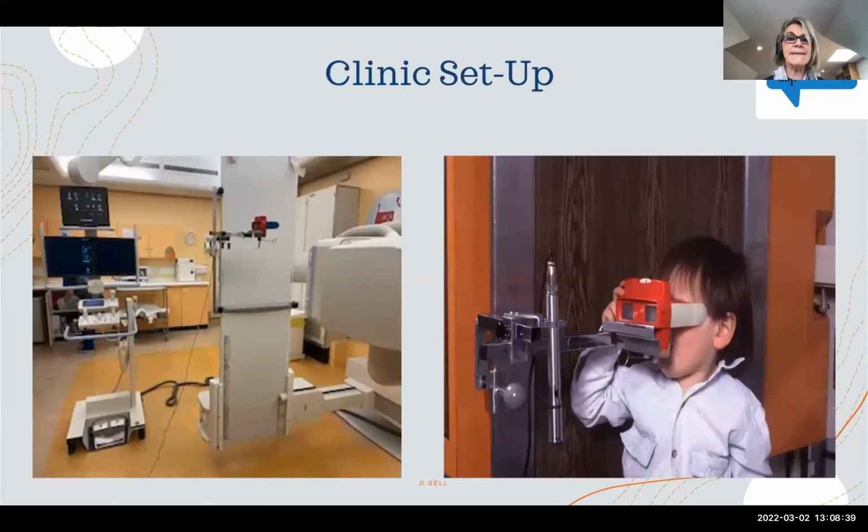So this is an image of the X-ray suite with a C arm here, and radiographer here, operating the machine, the patient here, and the speech therapist getting the sample. And on the right here, we can see a viewfinder to keep the head still, and this information is recorded.